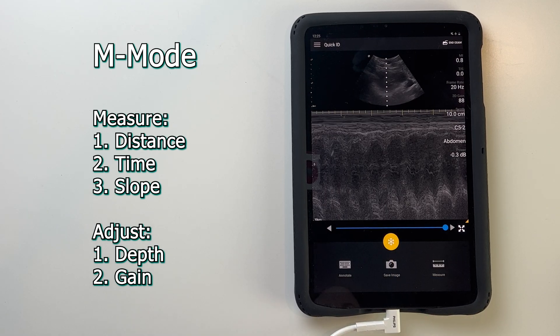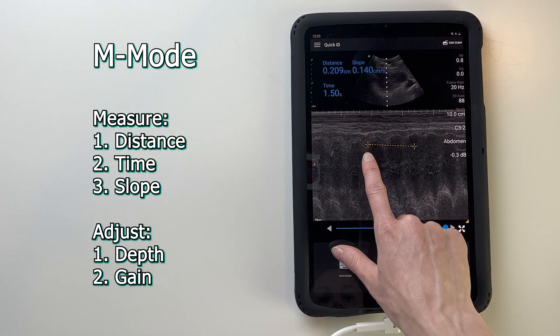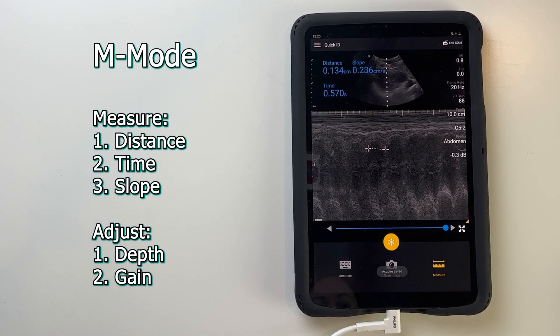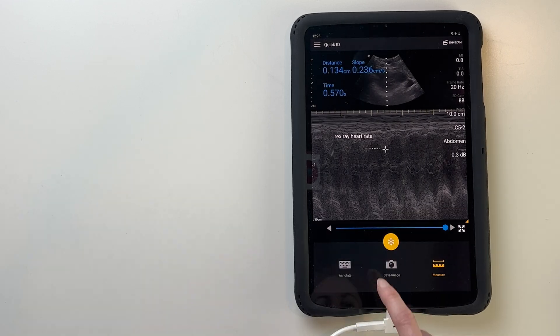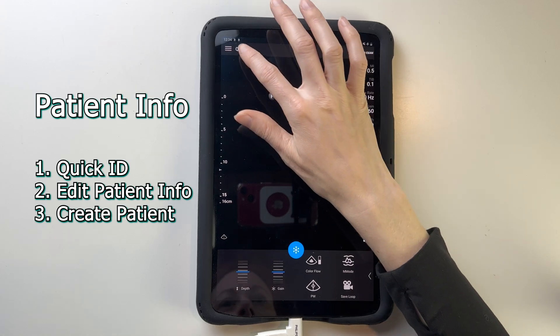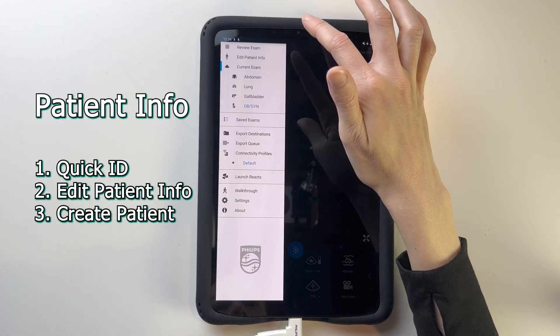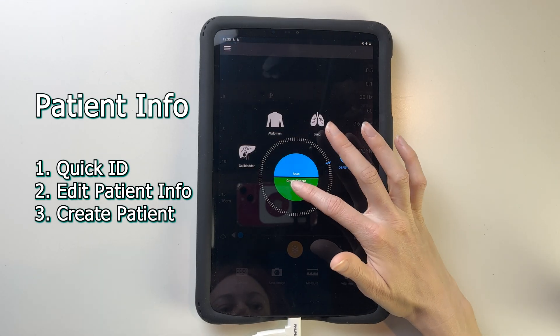When you freeze the image, you have the option to measure, annotate, or take a saved picture for archive. You can adjust the measurement by moving one crosshair at a time — this feature is most commonly used in obstetrics to calculate fetal heart rate. The annotate button brings up a keyboard, and you can move your annotation anywhere on the image. There are three ways to enter your patient ID: the quick ID button, editing patient info from the main menu, or creating a patient from the start screen.